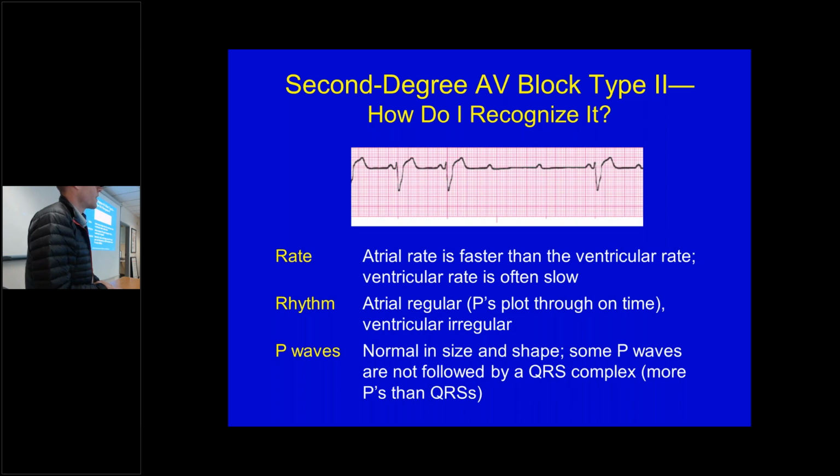It's still irregular. So that quick depolarization down is from the other branch depolarizing the muscle, and that slow, kind of wider rate is from the cell-to-cell electrical connection going through. So yeah, the wide QRS is from the cell to cell. But you have the initial, the good branch. What do you mean the initial steep one? Like that initial, I mean, because you have an R wave and an S wave in this, so it is an RS. I mean, you could say, yeah, the R is fairly fast and then it becomes delayed.